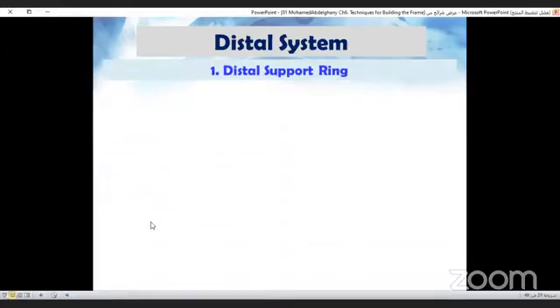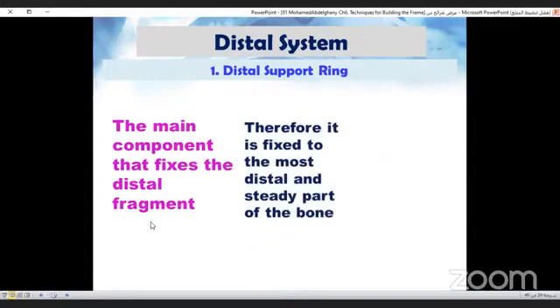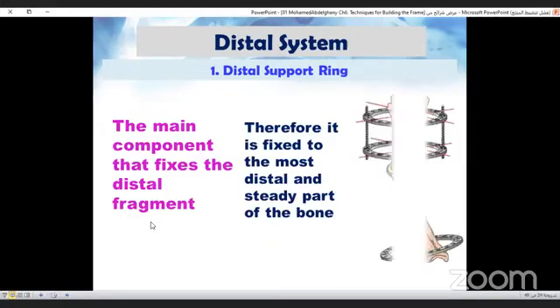The first ring in the distal block is the distal support ring. This is the main component that fixes the distal fragment. Therefore, it has to be fixed to the most distal and steady part of the bone.